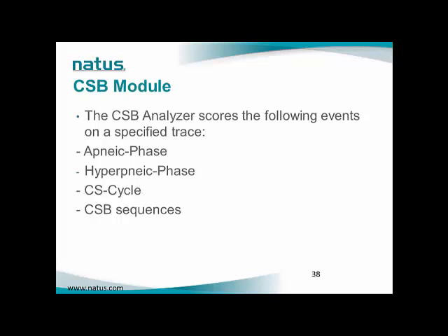The CSB analyzer in RemLogic scores the following events on a specified trace: the apneic phase, hyperpneic phase, CS cycle, and CSB sequences.